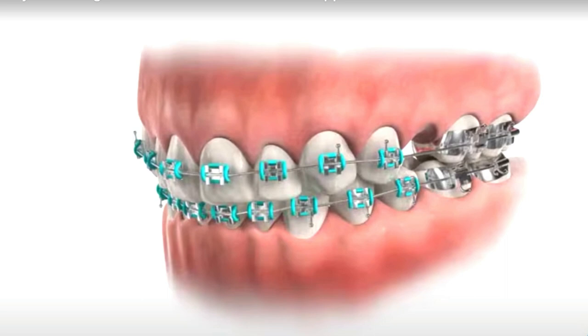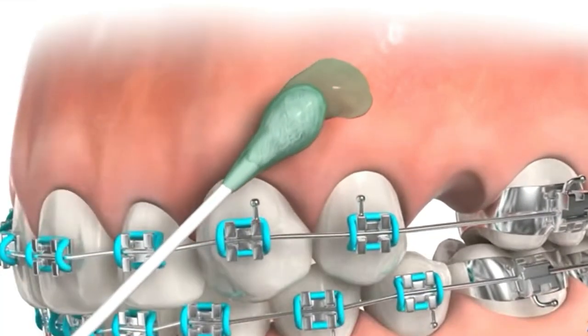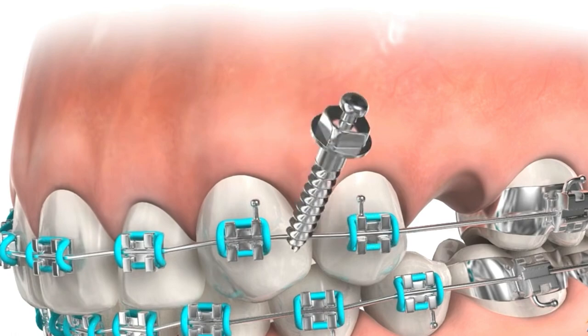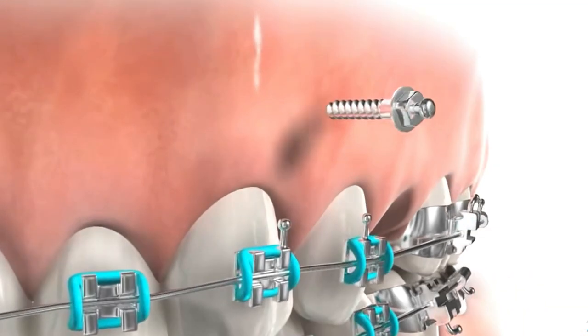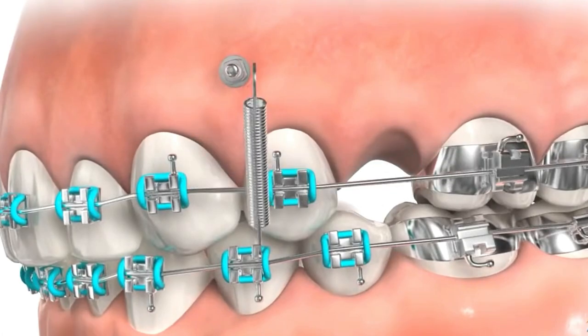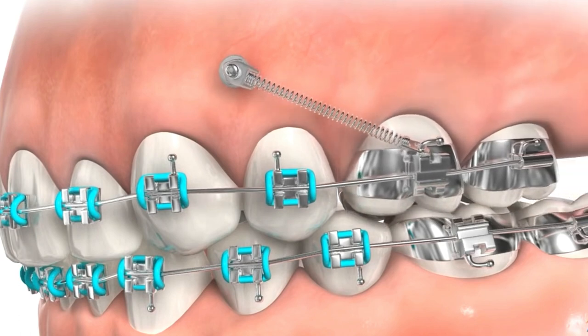The TADs act as stable points of resistance. The procedure involves the careful insertion of TADs into the bone, which is typically done under local anesthesia to minimize discomfort. Once the TADs are in place, orthodontic mechanics such as elastic or coil springs are attached to the TADs and connected to the molars. These mechanisms gradually exert forces on the molars, guiding them forward into their desired positions.